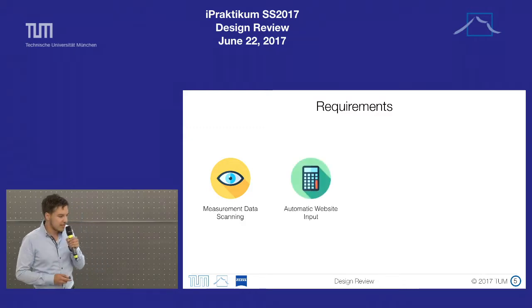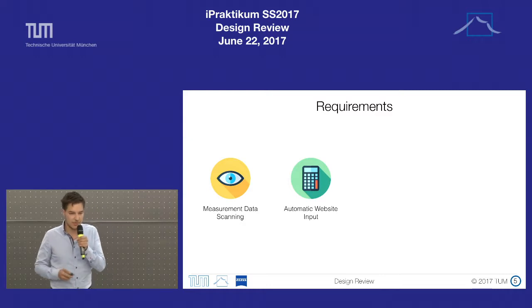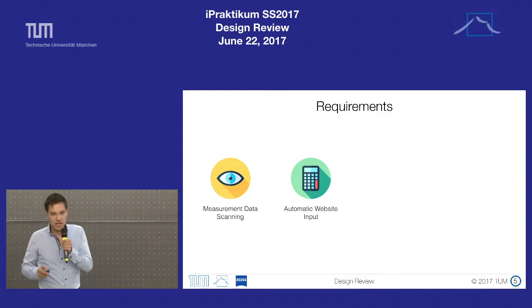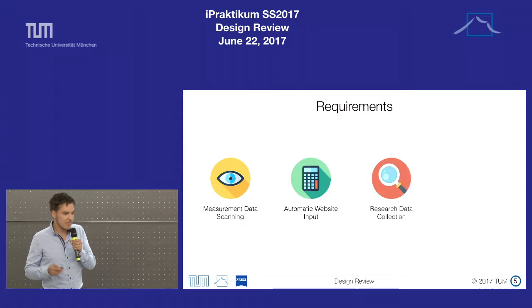The second big challenge that we have is the automatic website input. So the requirement is to put that data that got extracted automatically into a calculation website. This requirement is special because of a constraint. Due to the short project time span and medical regulations, it's not possible for ZEISS to offer an official API for us. So we have to make this possible anyway.